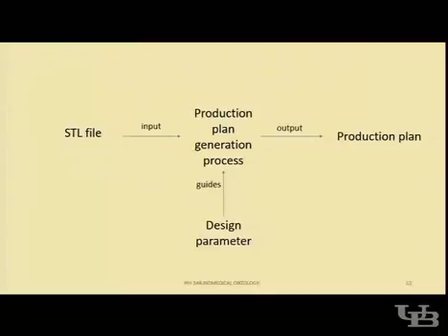So the design parameter could be in terms of the angle of the product, the gap, and also other types of parameters for the production plan to be generated.